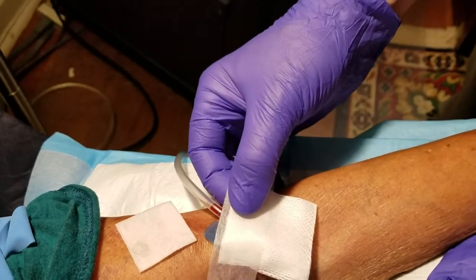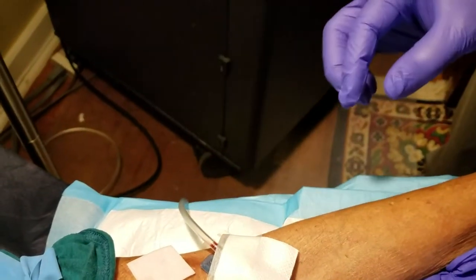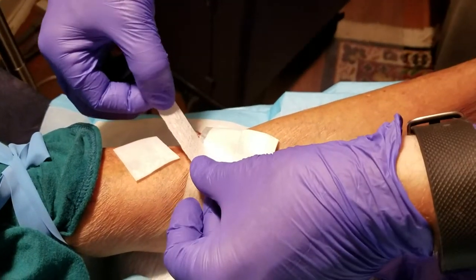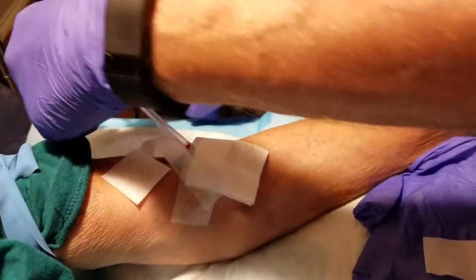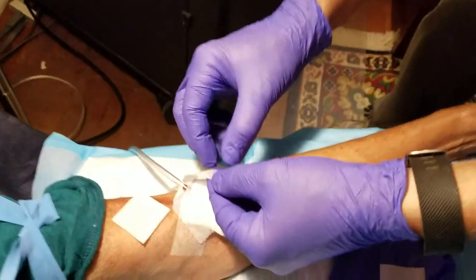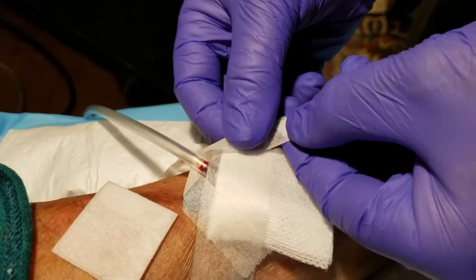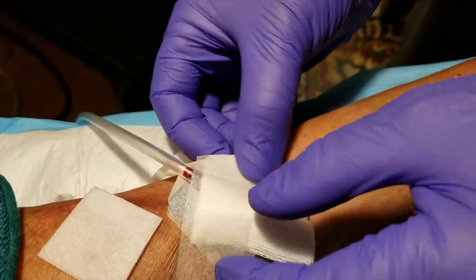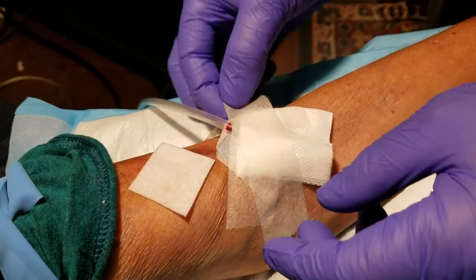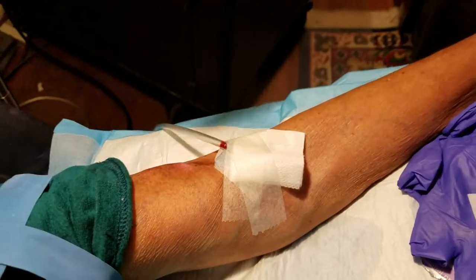Now you can see why I put the gauze on there, so that it's not putting tape on her site. Next we put what's called the chevron on here to keep this needle from sliding out. Fold the tape over a little bit so that it's easy to get off, and tape once more. So that's the arterial.